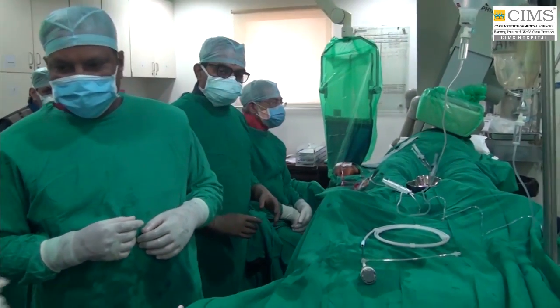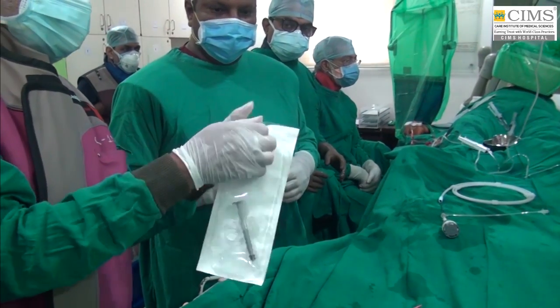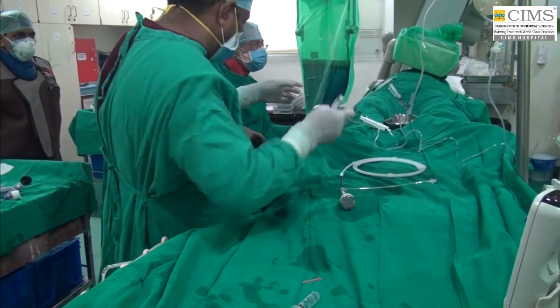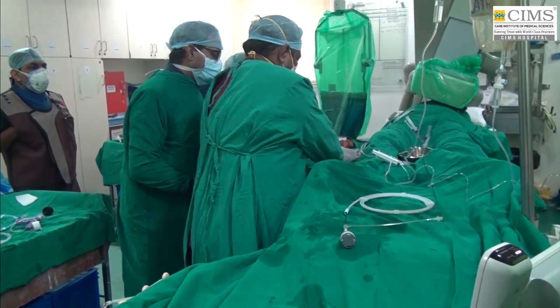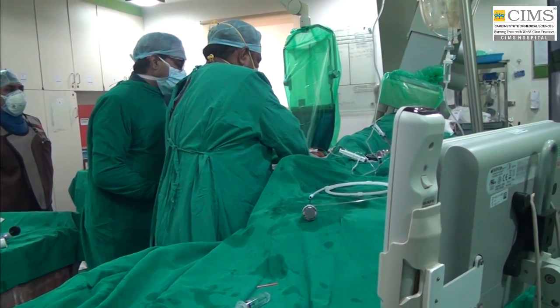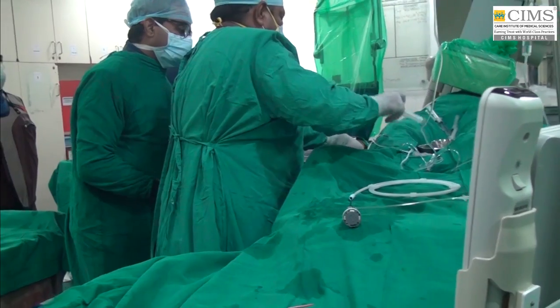What about OCT, Dr. Keyur? Do you use it in every kind of lesion, or is there any specific reason for OCT here? Our usage of OCT is about 30-40% of our cases. Of course, in all complex cases, long lesions, dissections, long thrombotic looking lesions, we should use OCT. Especially in this case when we don't know exactly what kind of lesion this is.